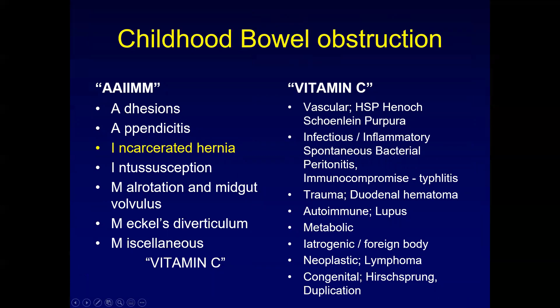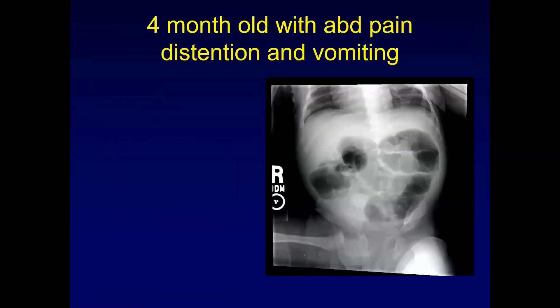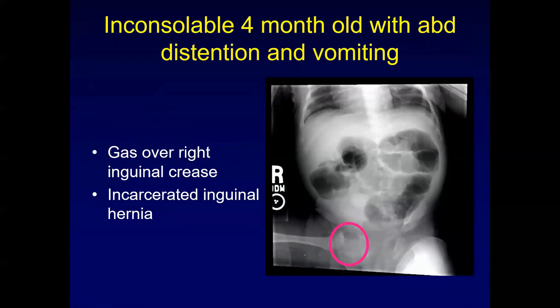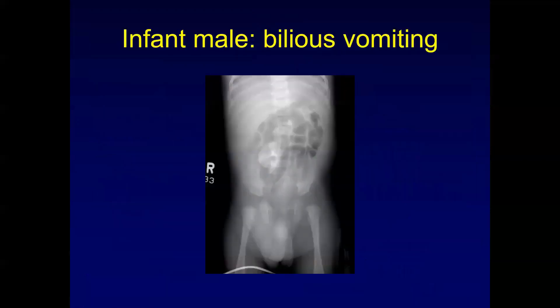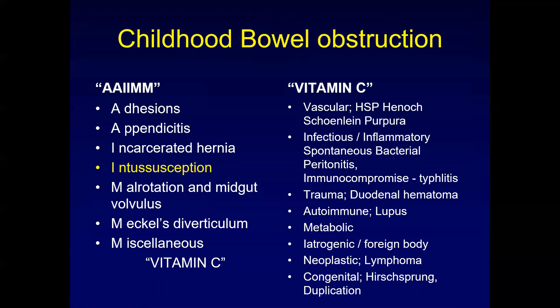Incarcerated inguinal hernias occur when bowel is non-reducible to its original or normal location. Here we can see gas overlying the right inguinal crease, consistent with an incarcerated inguinal hernia. A plain film demonstrates an abnormal bowel gas pattern with a soft tissue rounded mass density over the region of the umbilicus and asymmetry of the inguinal folds, as demarcated by the yellow highlight. This patient went to surgery for a bowel-containing incarcerated hernia. Ultrasound can at times be helpful for further evaluation or justification as needed.